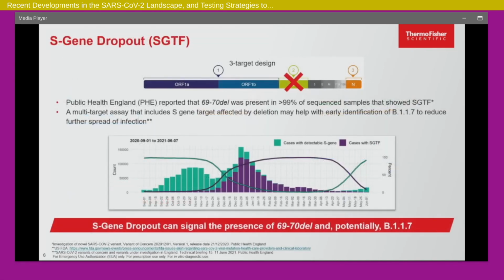At the same time, in different parts of the world, the virus was evolving. Now on the surveillance part of it, people were saying, okay, let's look and see what is happening in the rest of the world. This is about the dropout. Before I go to the next variant, let's talk about the dropout. We have a 3-target design in the assay, where you have the first target on the ORF1 gene, the S gene, which is the spike gene, and the N gene. You can see the S gene was constantly not present while they were running the assay. Interestingly, this is data that is coming out much more recently.